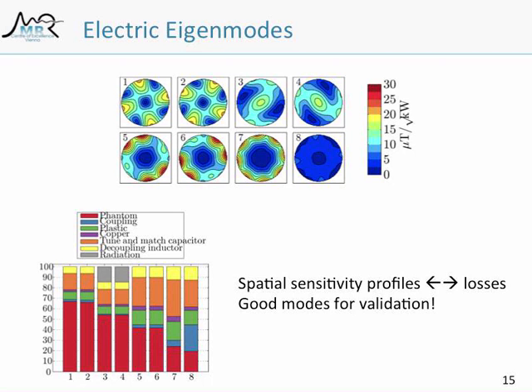So now we go to those 2 modes, those that look like the linear birdcage modes, and we see, oh, they're not that good. They have a lower power deposition in the phantom. And what we can see, those are the only 2 modes where power is radiated out of the bore. So all the other modes, there's basically no radiation loss. That's shown in gray, but these 2 modes have radiation losses.